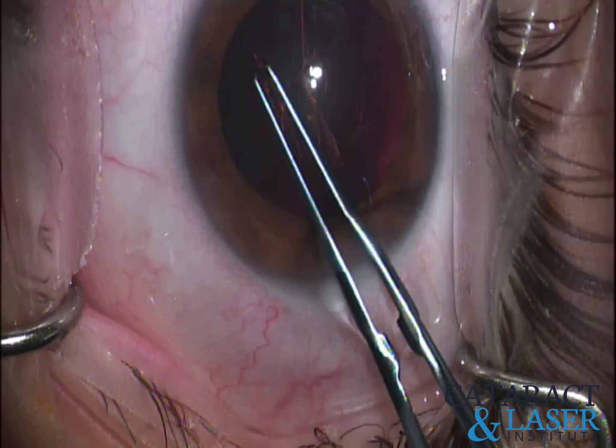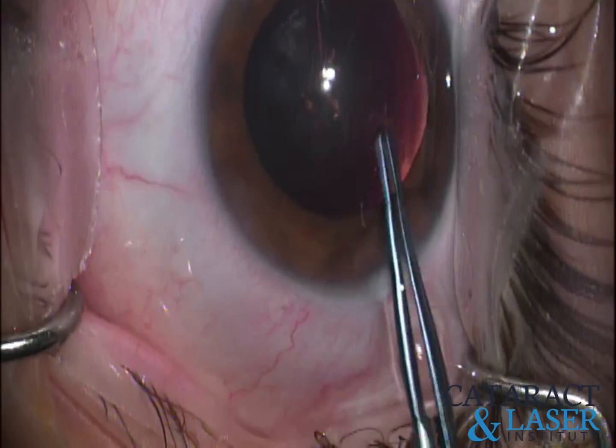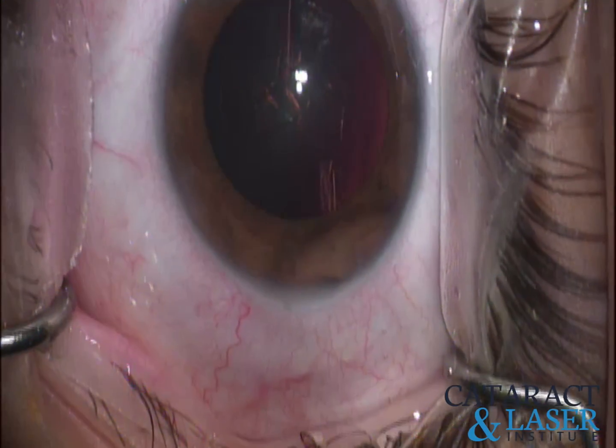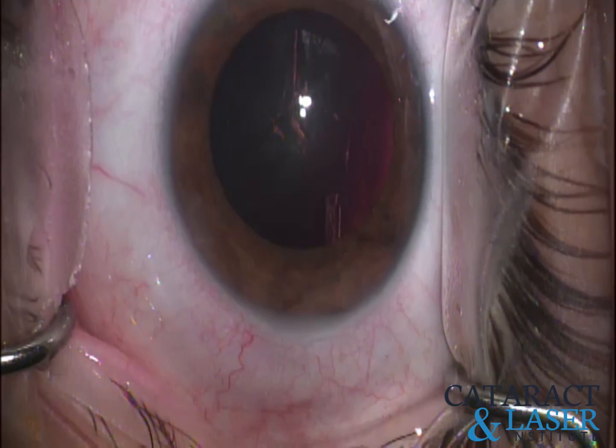I kind of err on a slightly larger rhexis with these younger patients because my goal is going to be to burp that entire lens forward, instead of dividing it and doing the divide-and-conquer technique.